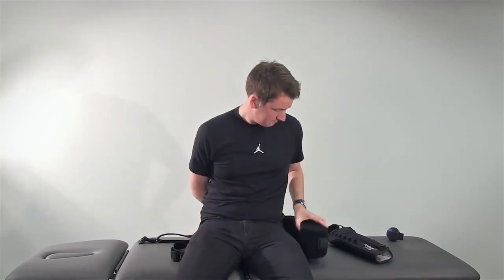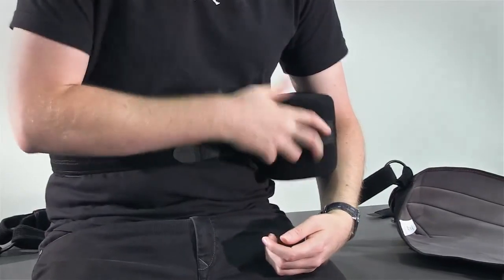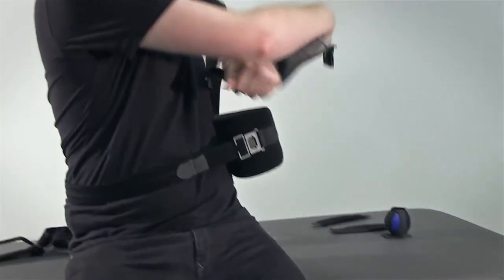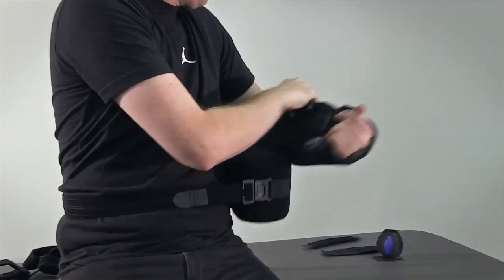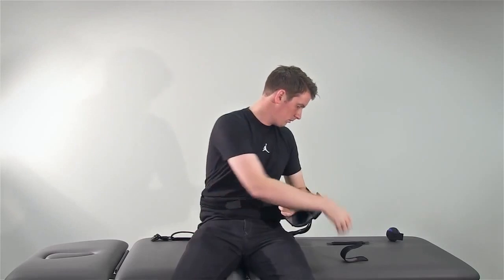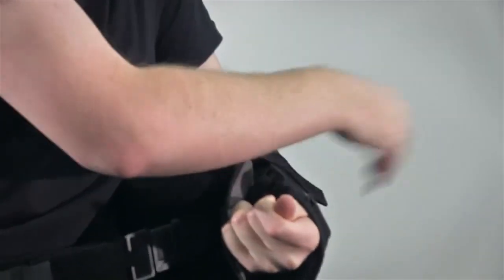Whilst seated, attach the cushion at waist level, bringing the waist strap around the back and attaching it with the buckle at the front of the cushion. Place your arm in the sling and attach the sling to the cushion. Secure the forearm strap to the sling and cushion before attaching the thumb strap.